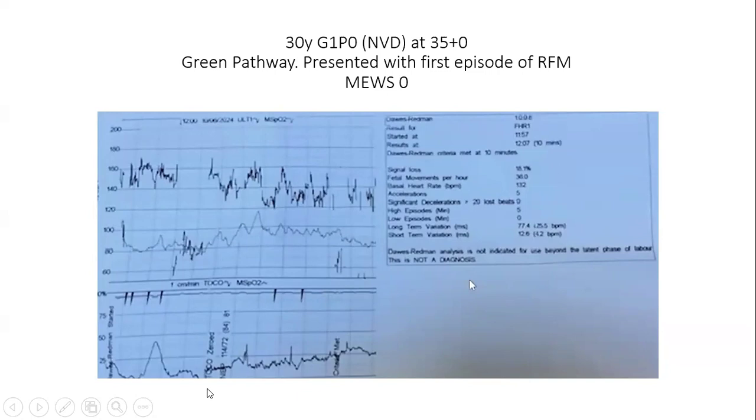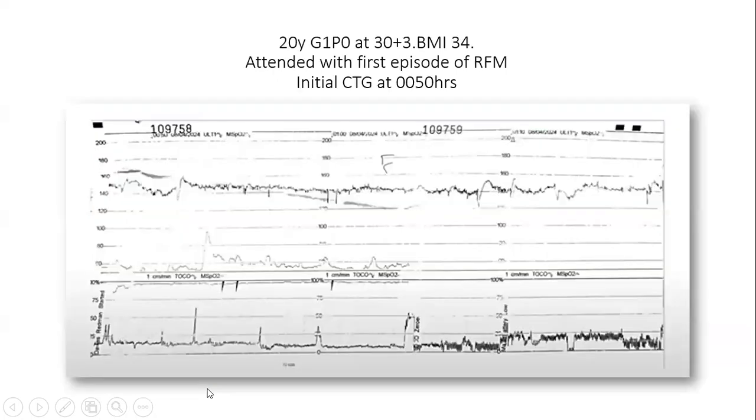But you realize how things are different for a patient with obstetric cholestasis and this patient. In one, you're planning delivery for criteria met. In another, you are just planning a scan. So what you do depends on the context.